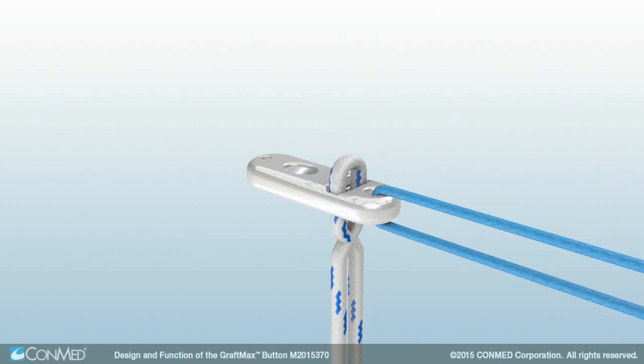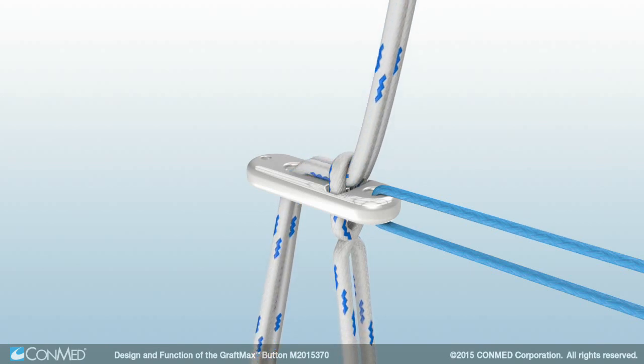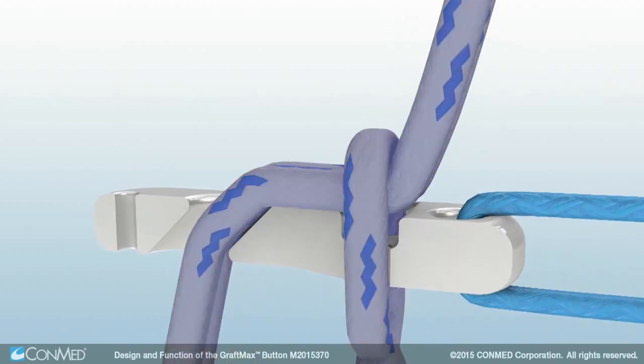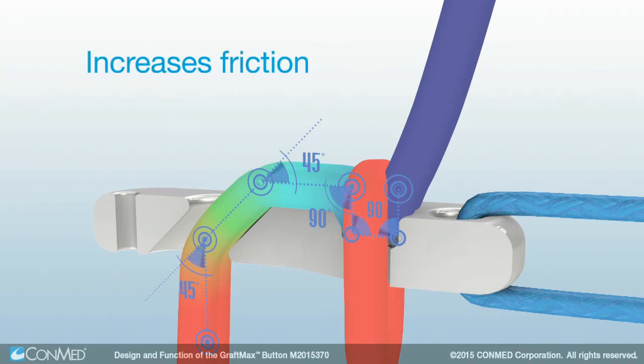The adjustable loop is then created by passing the suture tails through the button's tortuous path and under the locking loop. The tortuous path of the suture through the button increases friction and reduces force with each turn to just a fraction of the original at the point of locking loop contact.